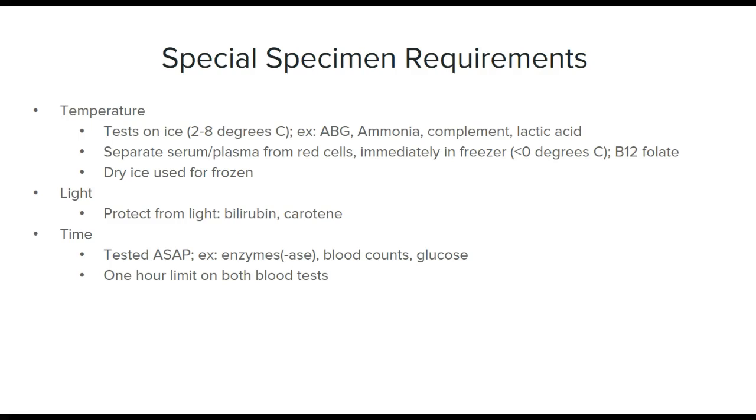Okay, some tests have special requirements to them, and you need to know these. Specimens like a blood gas or ammonia, those are the most common. Complement and lactic acid have to be put on ice right after you draw them. So most of the time, a phlebotomist or respiratory therapy will take a cup of ice with them, or a specimen bag with ice in it, and go straight to the patient's room, put it on the ice, and then bring it straight to the lab.